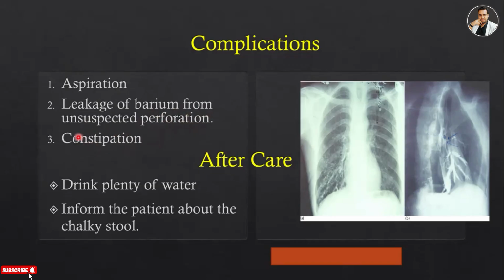And then constipation, that means the patient may have difficulty in evacuation. And aftercare for this procedure is to drink plenty of water. That means ask the patient to drink plenty of water after this procedure, and inform the patient about the chalky stool. That means the patient may have white stool, and the patient may feel nervous and anxious. So after the procedure, explain that you may have chalky stool, so nothing to worry. So these are the complications and aftercare.